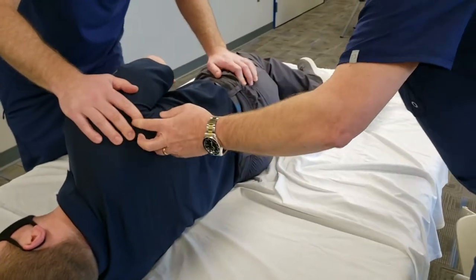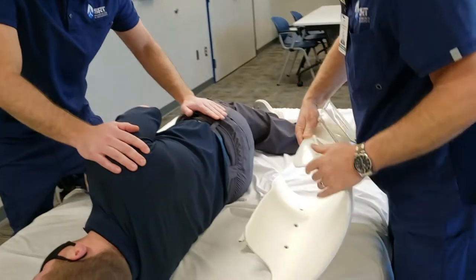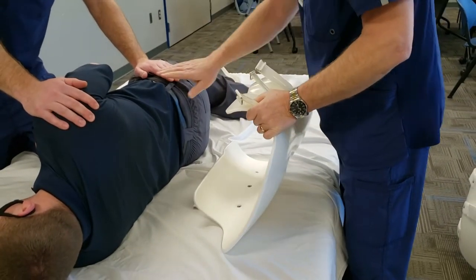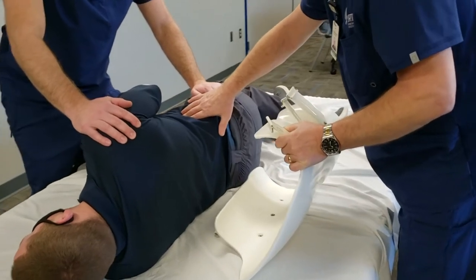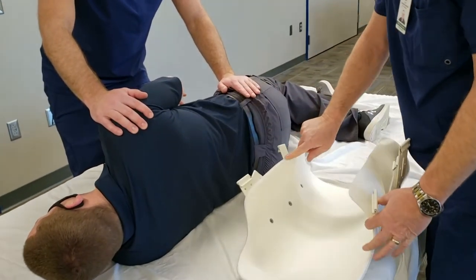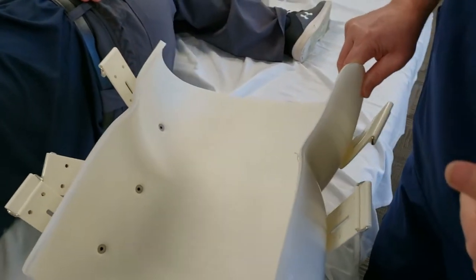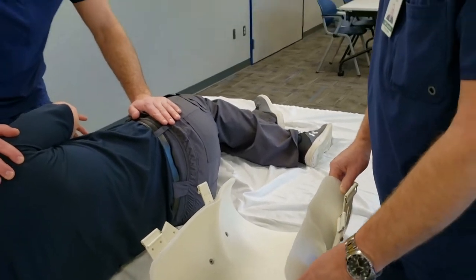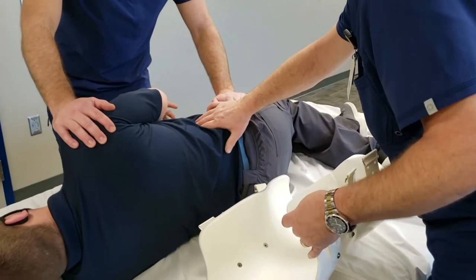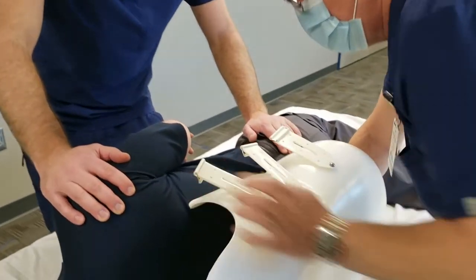Which side you roll to is really up to the patient and how their other injuries may be involved. Now I want to palpate and find his hip — right there's the iliac crest. I want to put this waist groove — this bump, if you will — in the brace just above the iliac crest. That way you know every time you have the brace positioned correctly top to bottom. So palpate the iliac crest and put this down underneath him.